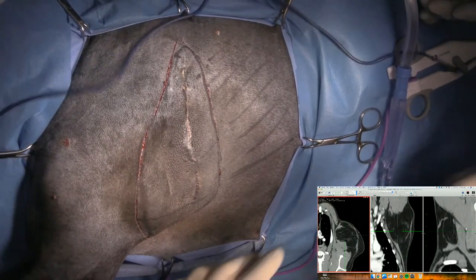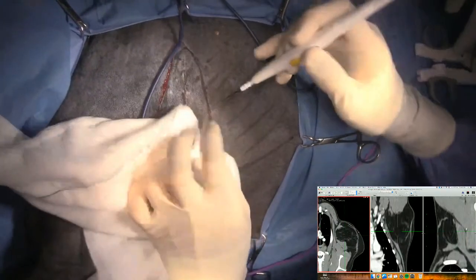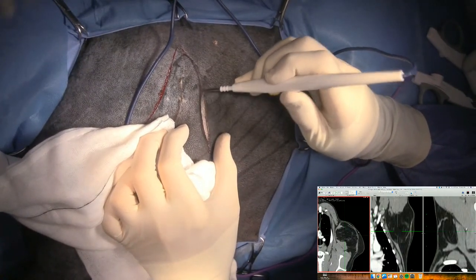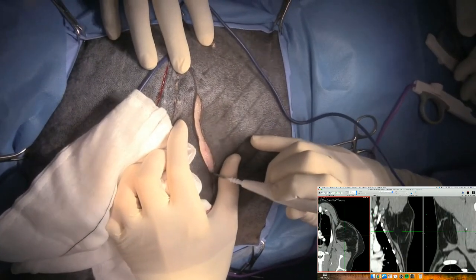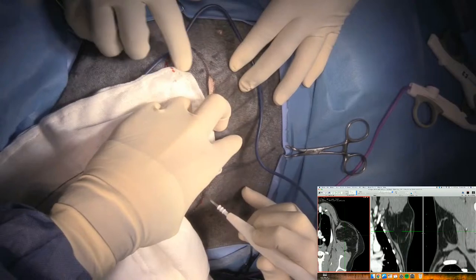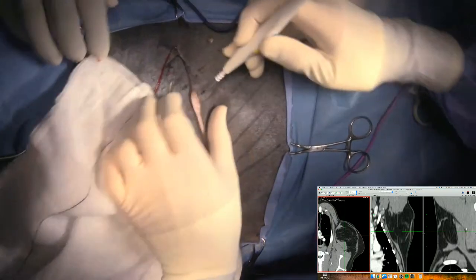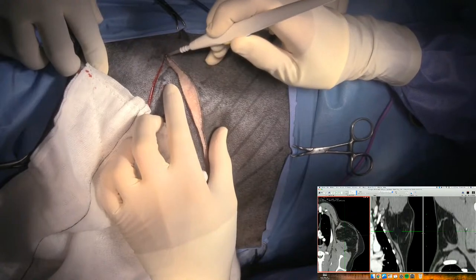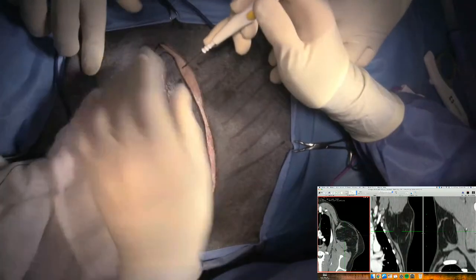And this can be done, because I've seen in an experimental model that we're going to use the latissimus dorsi as a cuff around the heart to assist with myocardial contractility in dogs with dilated cardiomyopathy. And so you can remove the entire latissimus dorsi muscle without a significant impairment in function. It's actually amazing how many of the muscles in the dog you can remove without significant functional impairment.